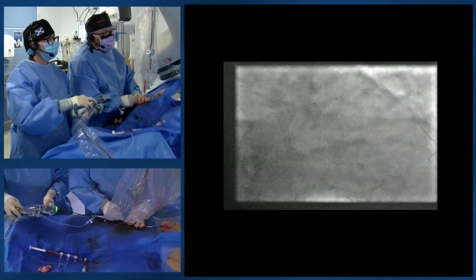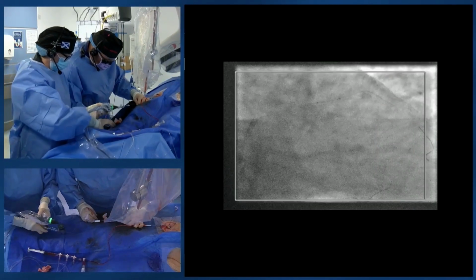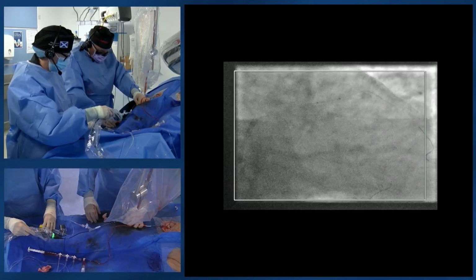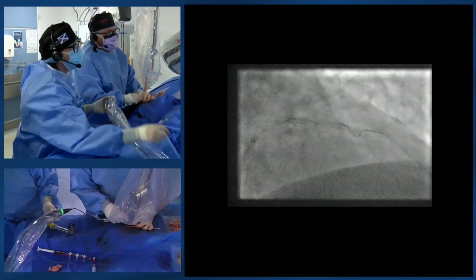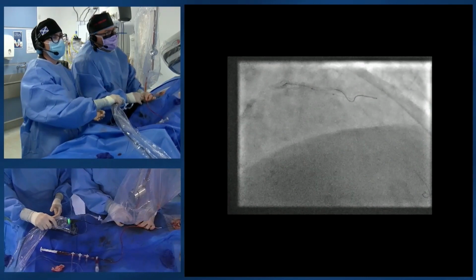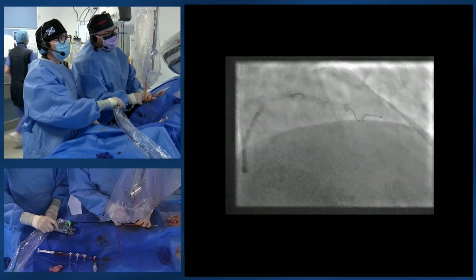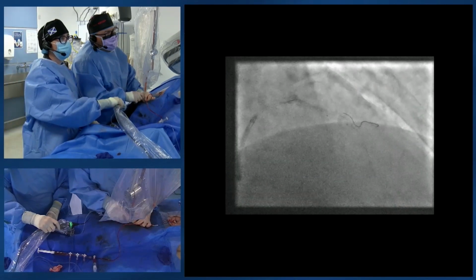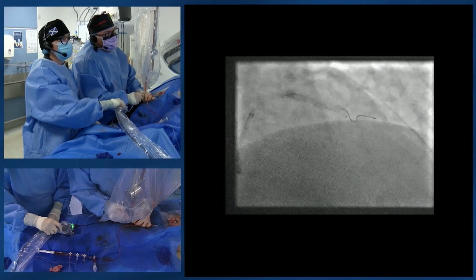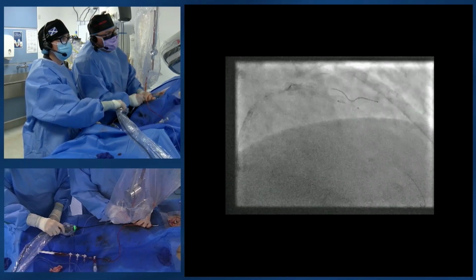Okay, nice. Okay to that point. Go to the cranial view now, please. Fantastic. I'll just follow this down. Yeah, so it stopped right at the area where the non-compliant balloon wasn't fully expanded. Okay, there you go. Oh, it's going to go. There you go, yeah. So that's, I suppose, the main bit we want to treat. Yeah, I think I'm having to push quite hard there, Margaret. There you go. I think it's jumped on.